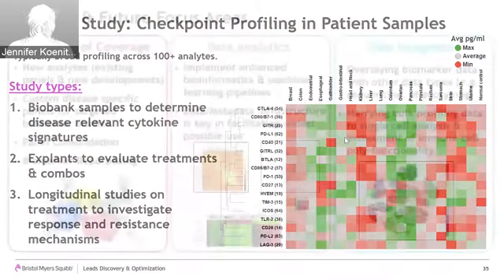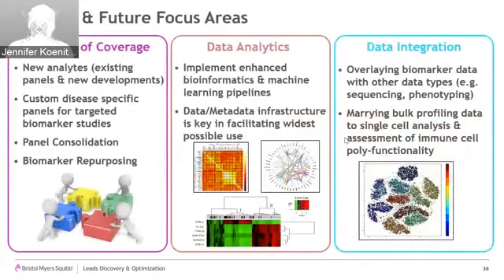With that, I hope I was able to give you a flavor for how we use multiplex biomarker profiling in IO discovery at BMS, and I want to finish with an outlook on our current and future focus areas. An ever ongoing effort is the expansion of coverage, so adding new panels of analytes to the platform or developing new analytes altogether in close collaboration with Millipore.